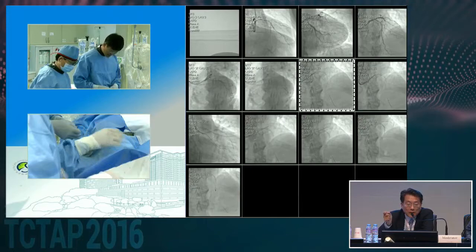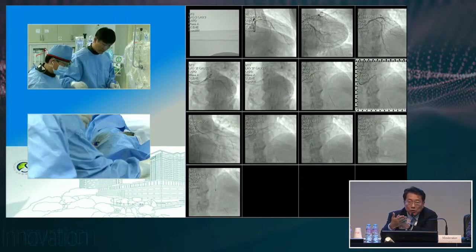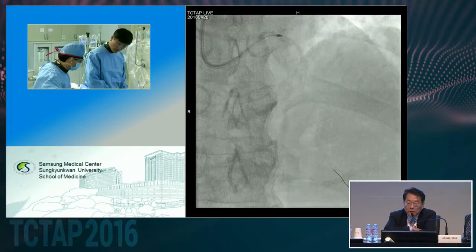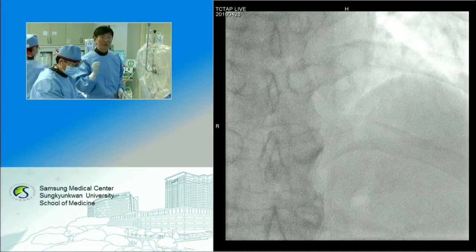I would like a slower back and forth motion to break down the calcific lesion. Sometimes the speed of rotation slows down in the case of heavy calcification. Personally, I prefer slower back and forth, especially when there is some resistance. Gentle movement is better, because sometimes it gets stuck somewhere and is difficult to remove. Right. Usually Japanese doctors prefer high speed and very rapid pecking motion. In other countries it's slower. It's quite various.